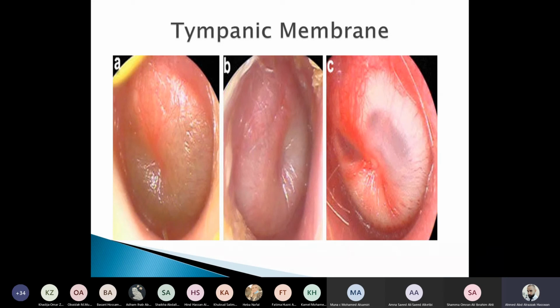What will this tell you about the condition of the middle ear? What is causing this bulging? Yes, increased pressure. So yes, fluid. This pressure is building up. Yes, inflammation or congestion. So simply we have what's called suppurative otitis media. So we have otitis media, and there is inflammatory fluid which is actually pushing the tympanic membrane.